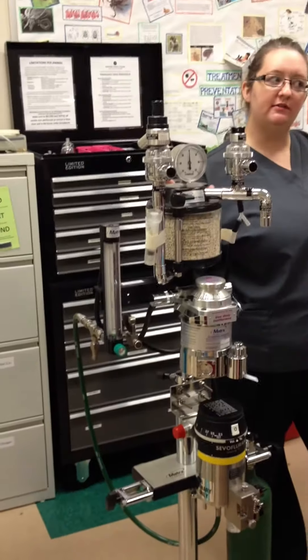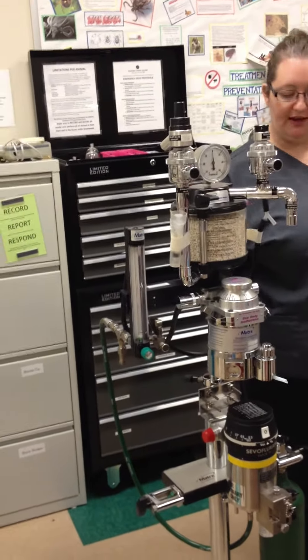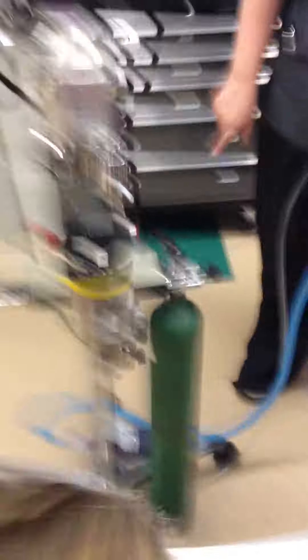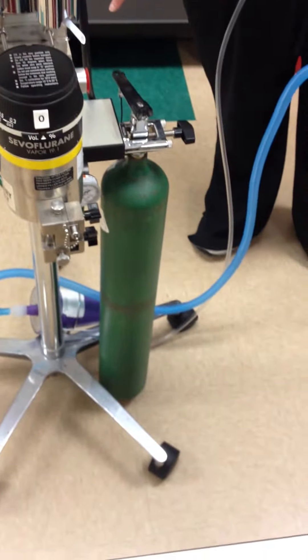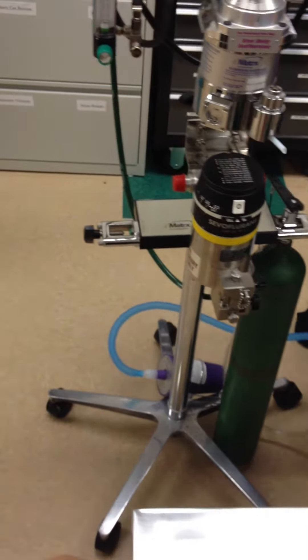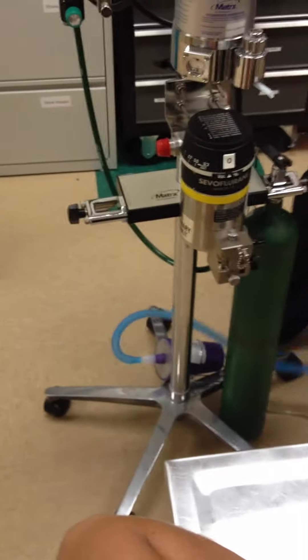Do you guys remember the parts of the anesthesia machine? Okay, what's this? Oxygen tank. Oxygen tank. What number or letter? H. Big H. H is huge.